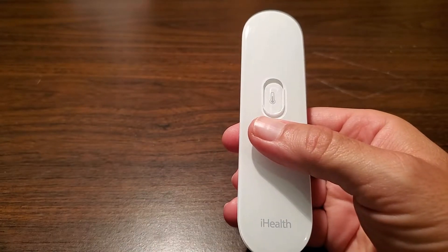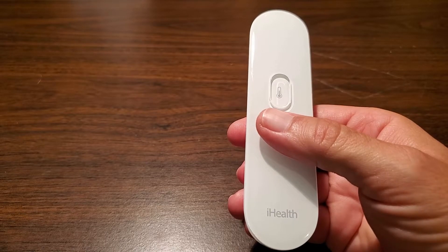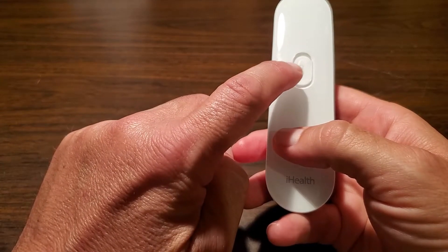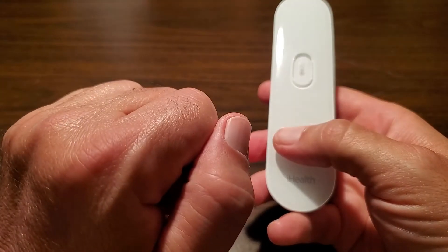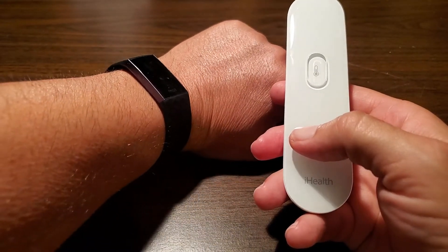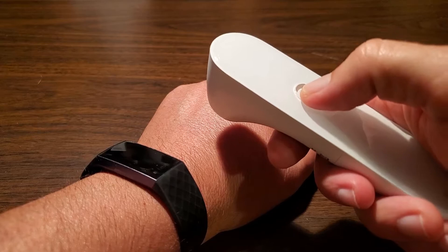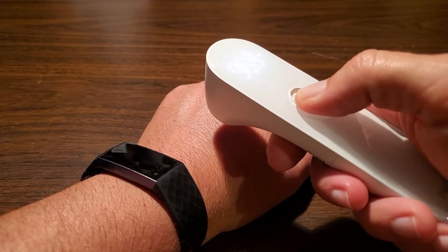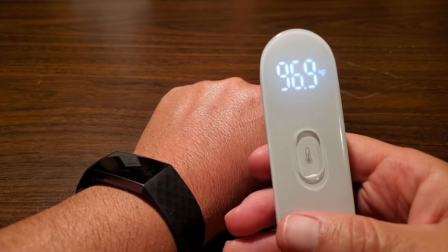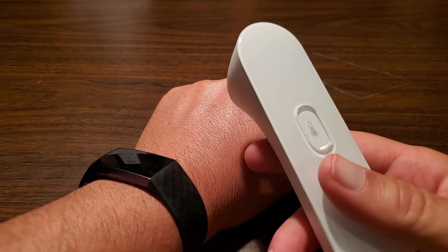It's pretty simple. To use the thermometer, just aim it at your forehead about one inch or three centimeters or less from your forehead, and press and hold the measurement button right here in the middle. It'll vibrate when it has a good reading. Just for the sake of this video, I'll take a reading off my hand — I need to hold it about an inch away and press and hold the button — and it already has a reading. It's off because it's my hand, not my forehead, but it's as simple as that.